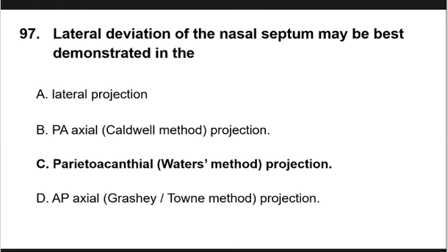Is it the fracture of the nasal bones is nakalabas, di ba? O kaya papaloob, no? Sa lateral makikita yon. So sa Waters, doon mo makikita kung mayroon bang lateral or medial deviation of the nasal septum. So that can be demonstrated in Waters.